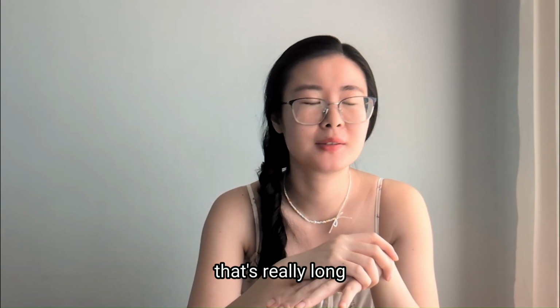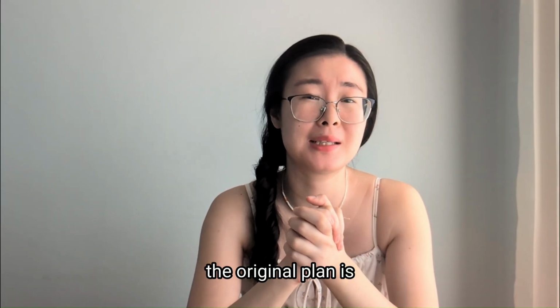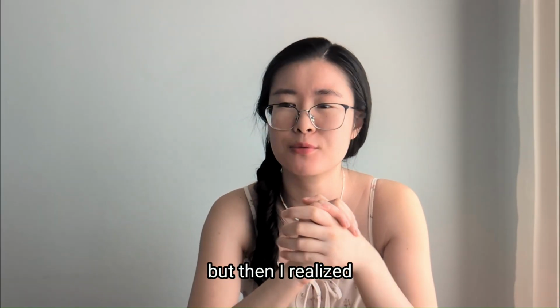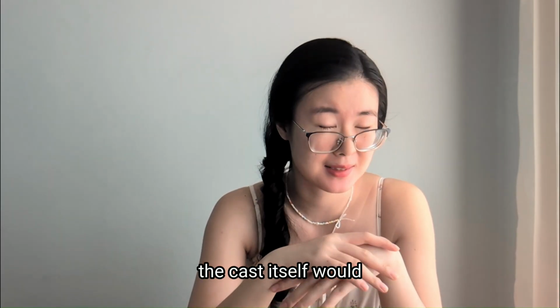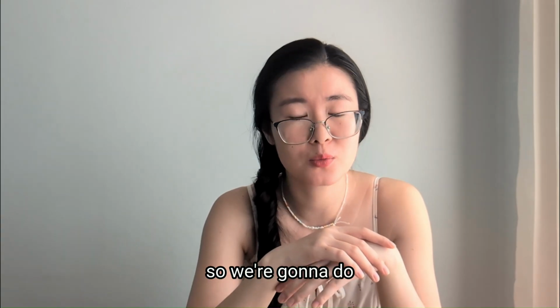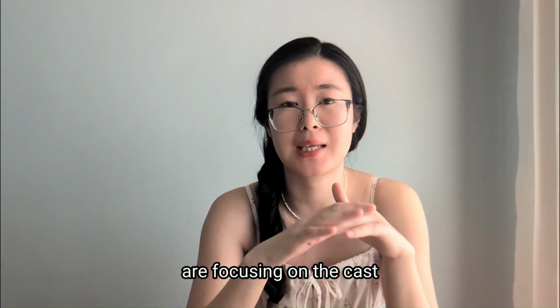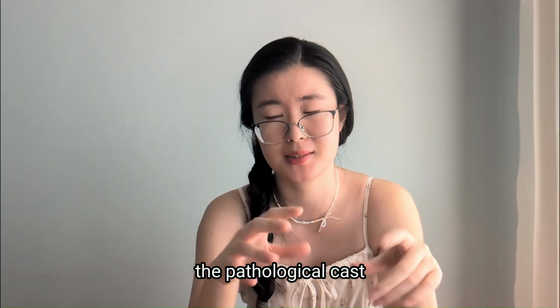Wow, that's really long. So the original plan is this week we're gonna do the cast and crystals, but then I realized the cast itself would take a whole episode, so we're gonna do the crystals next week. So this week we are focusing on the cast, the pathological cast.